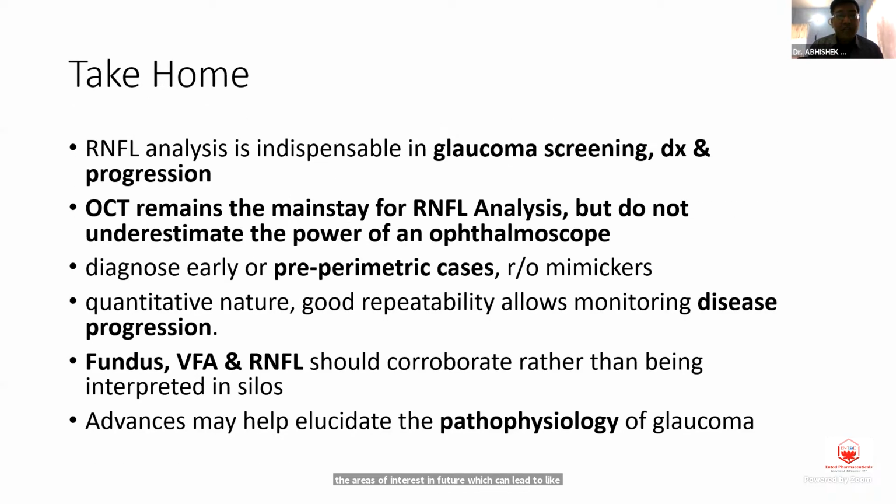and their pathophysiology as well. So, in the end, I would like to conclude that RNFL analysis is indispensable, because that is where the pathology lies, that is where the disease lies, that is where the anatomy lies. So it is helpful in screening, diagnosis, as well as progression of glaucoma.